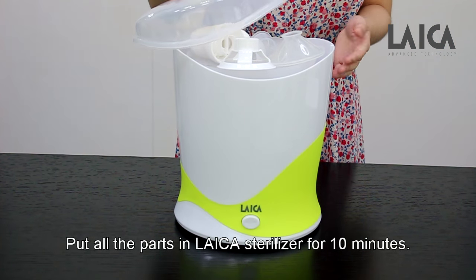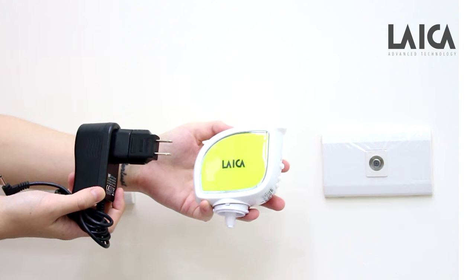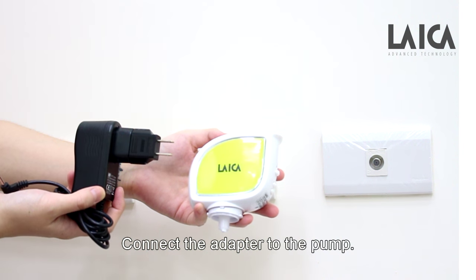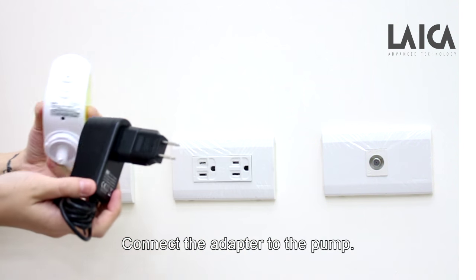Put all the parts in a sterilizer for 10 minutes. The pump must be charged before use. Connect the adapter to the pump.